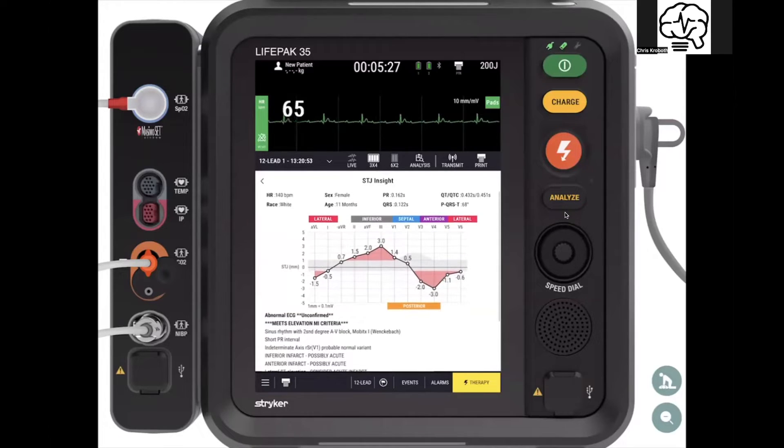The other nice thing is it takes you to both sides of the fence when it comes to elevation and depression. Here we have elevation in II, III, and AVF, and depression in V3, V4, V5, V6. Since we did a traditional 12-lead rather than a 15-lead, it tells you which of those would be posterior leads.